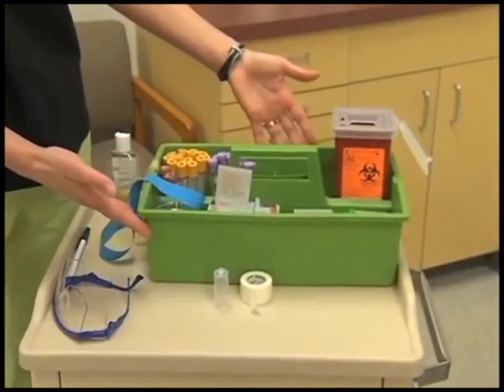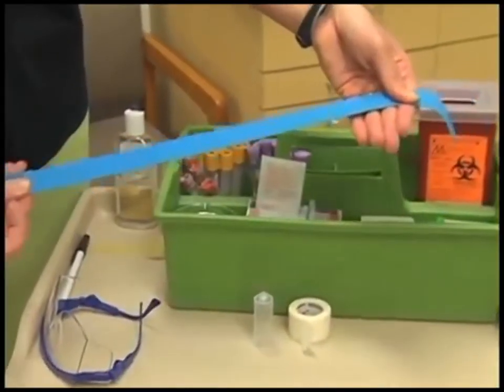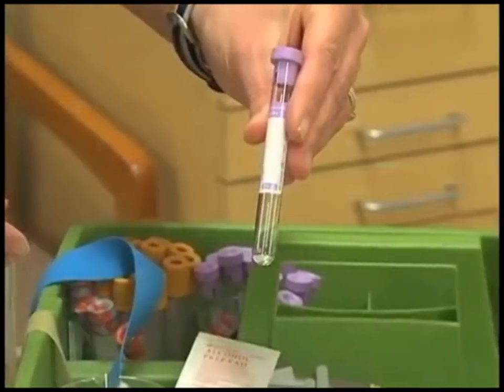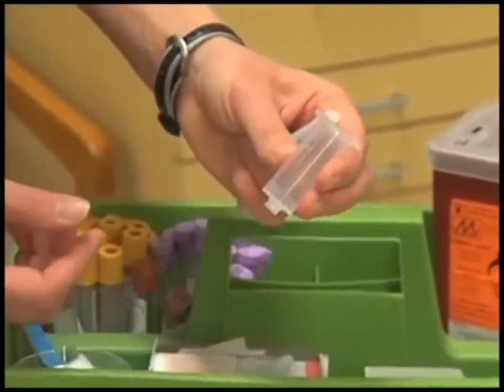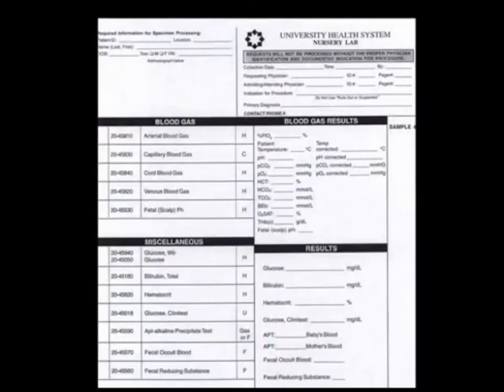Here are the supplies needed for venipuncture with the vacuum tube method: disposable gloves, tourniquet, safety glasses, adhesive bandages, cotton balls, antiseptic wipe, evacuator tubes with labels, plastic holder, double pointed needle, biohazard sharp container, and laboratory requisition form.